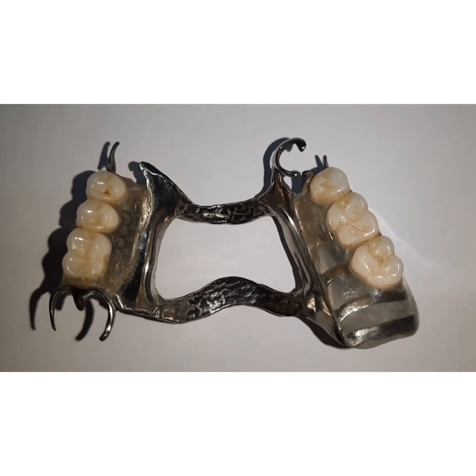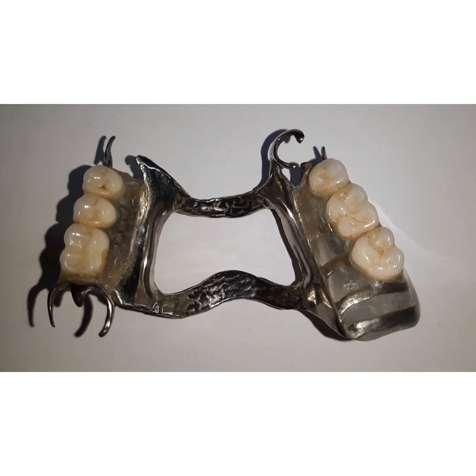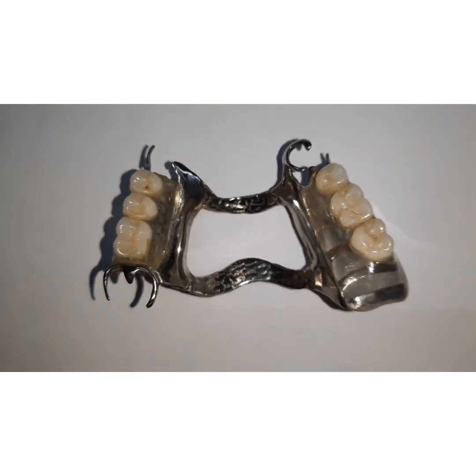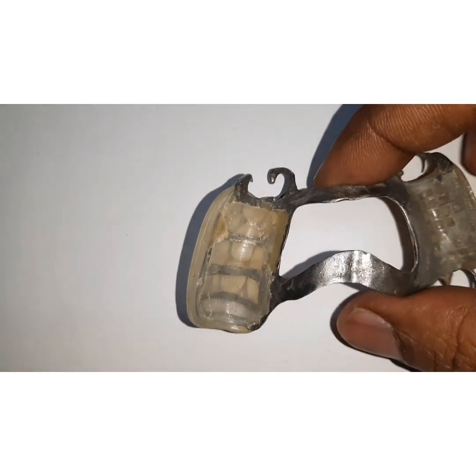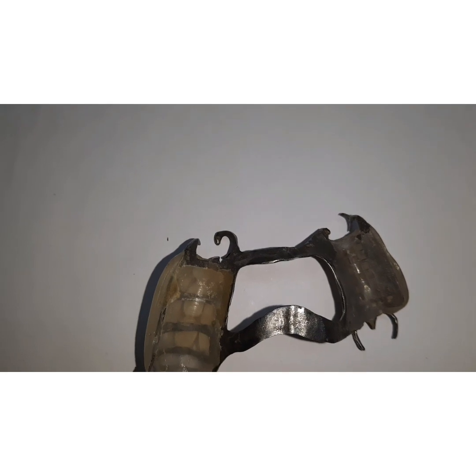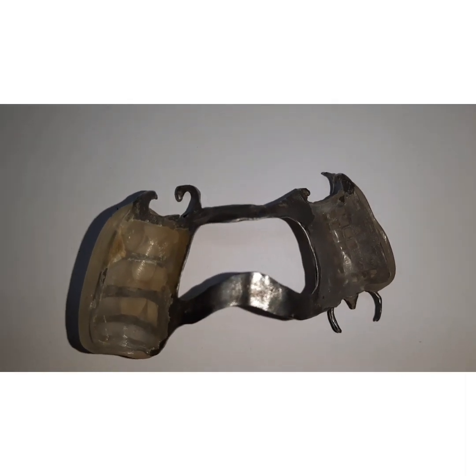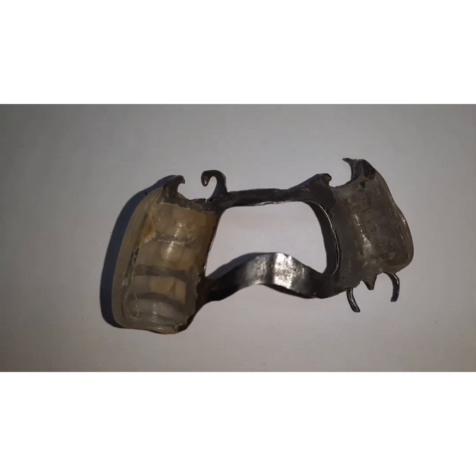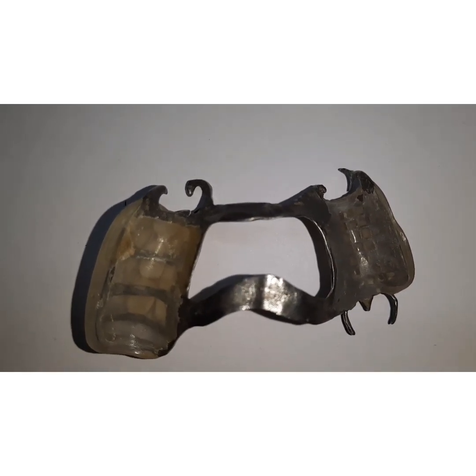So you may have a problem because of the denture base, because there could be polymerization shrinkage at the time of processing. So processing errors can be there because of the denture base. You may have a problem with the fit because of this area, that is the impression surface of the denture base region. For this region, you can apply pressure indicating paste with the help of a brush on this area at these borders, and then try it in the patient's mouth. Wherever you see that the paste is being removed, that indicates some kind of interference, and that needs to be trimmed with the help of an abrasive stone.